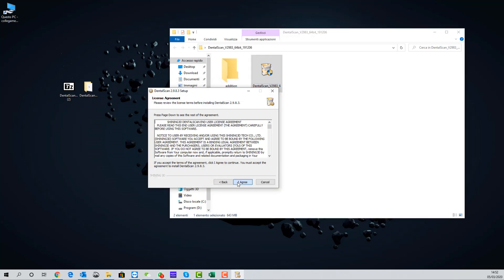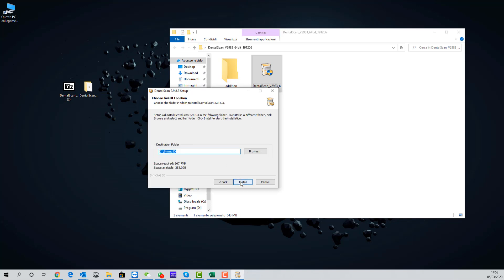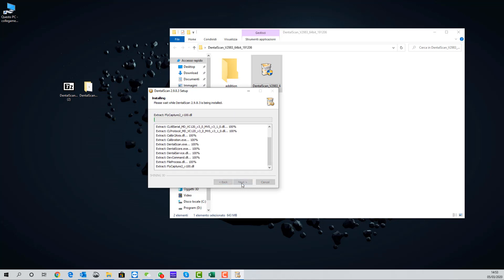And then automatically the installation process will start. Select the device that you have on your desk. Check the installation folder, should be Shining 3D in your C drive.